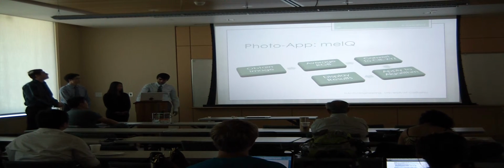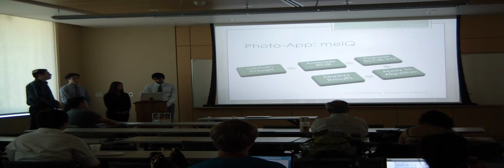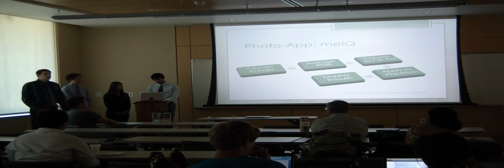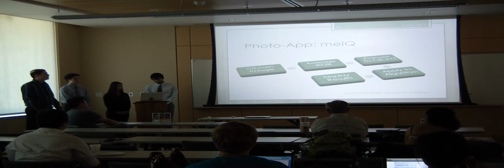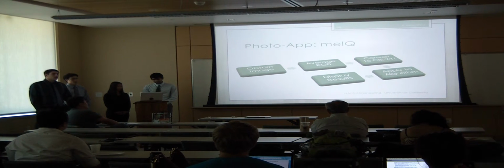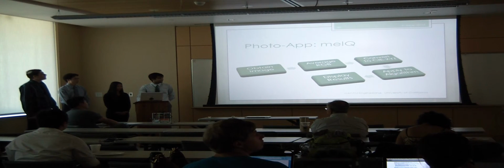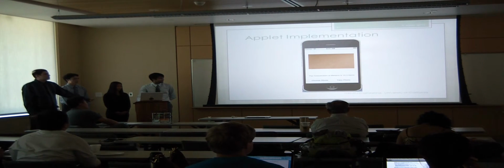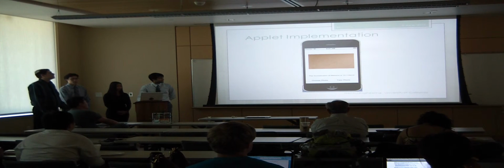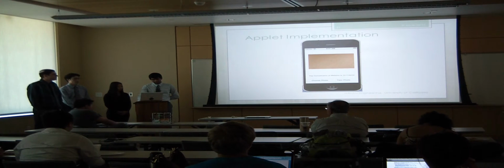So here we obtain an image from the camera, as a set. Obtain the average RGB values. Then they are converted to the standard color scale X, Y, Z. Those values are able to go into our correlation algorithm, and then it will display the result on the phone. This is an example of what a display of concentration of melanin looks like at the end of that schematic.